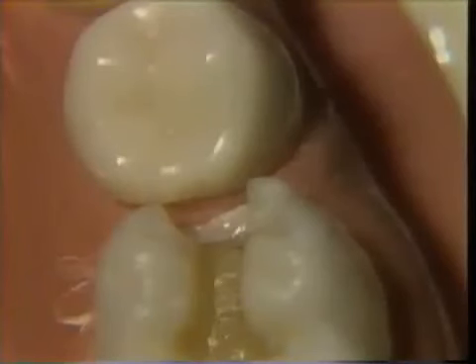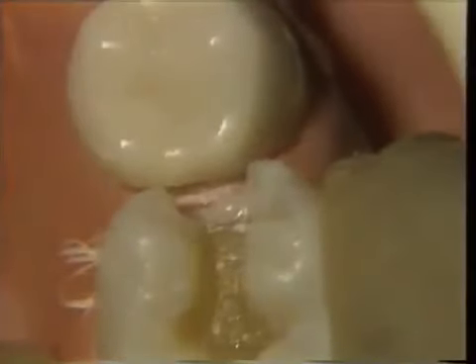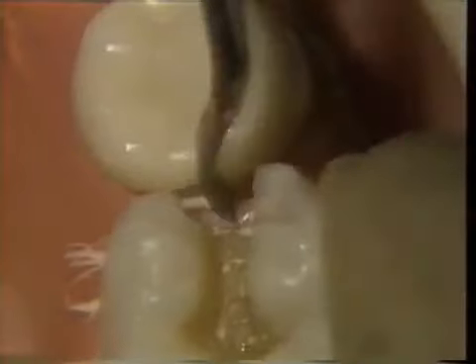As the instrument is being carried across the cervical floor, it must not strike the cervical corners of the proximal box. If this happens, a sharp groove is cut into these corners, and it is difficult to properly condense amalgam into these areas. Therefore, as the beveling is started, the marginal trimmer should be started 1 or 2 millimeters on the proximal wall and brought down the proximal wall, past the corner, and out onto the cervical floor for 1 or 2 millimeters. Then the normal movement of the instrument pulling across the cervical floor is accomplished. Then the gingival marginal trimmer is used to bevel the pulpal axial line angle.